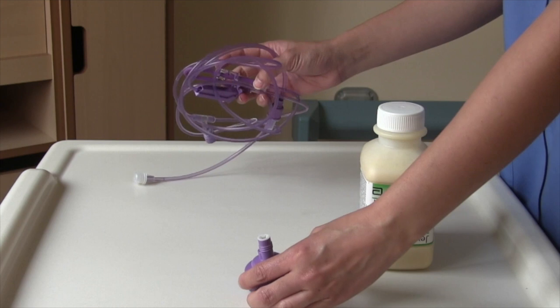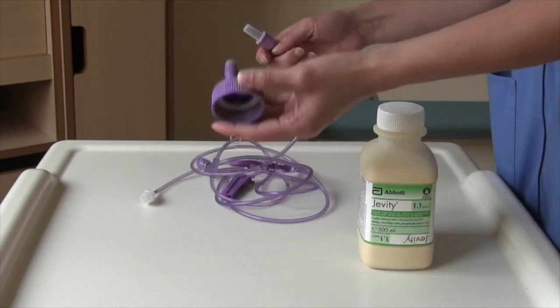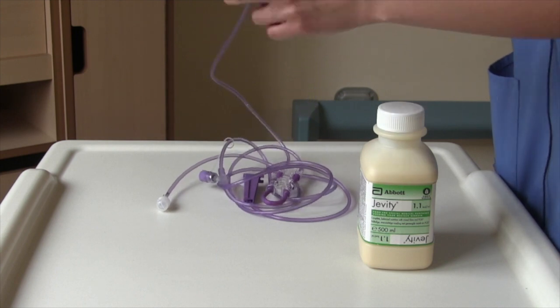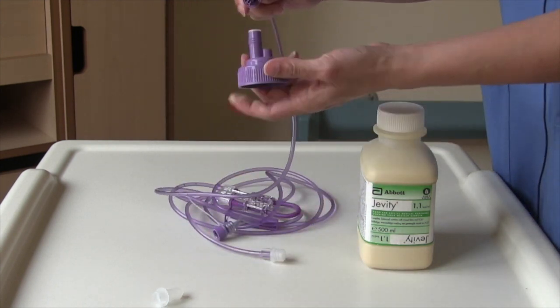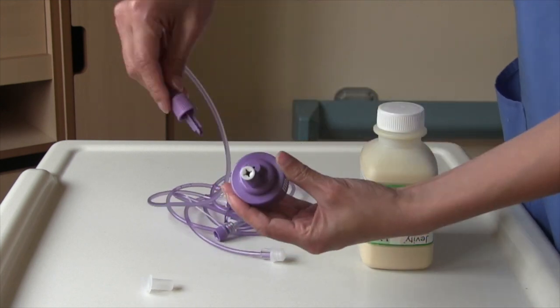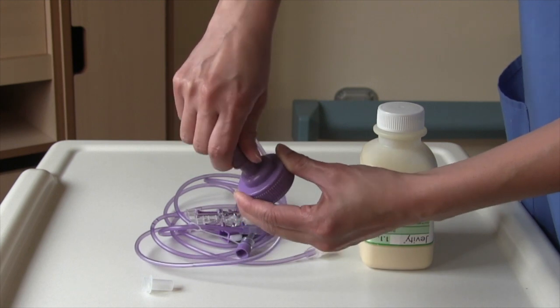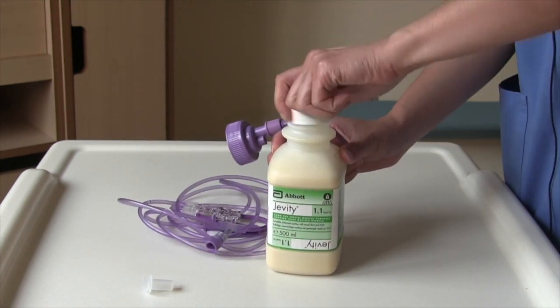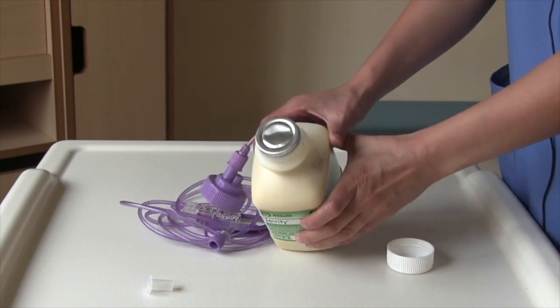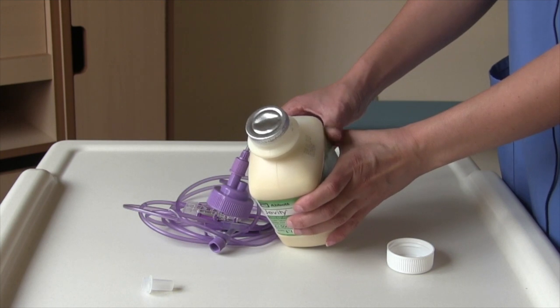Take the adapter and the giving set out of the packages. Connect your adapter to the giving set by finding the end of the giving set that has a long cap. Take the cap off and line the end of the tube with the insert of the adapter and turn to tighten. Take the protective cap off your bottle of feed. You do not need to break the seal with any objects.